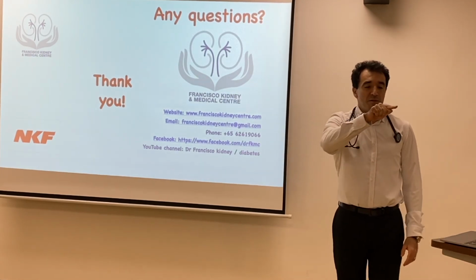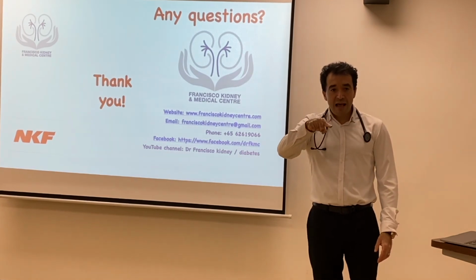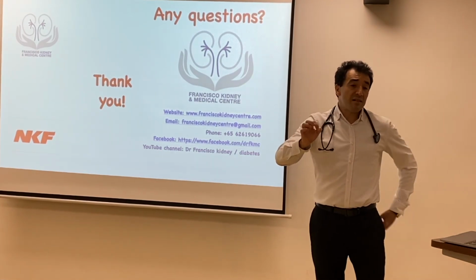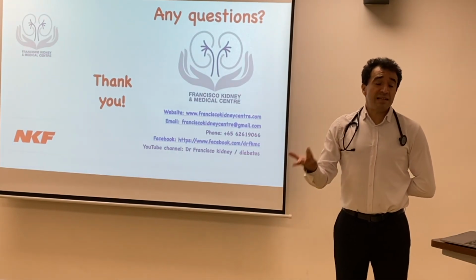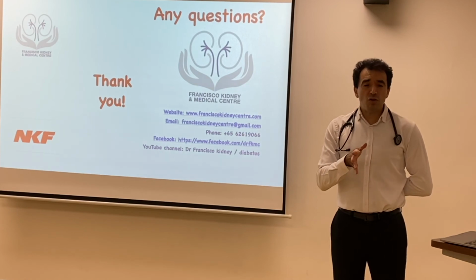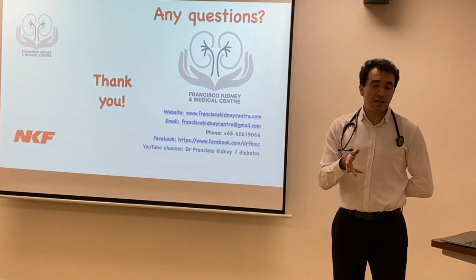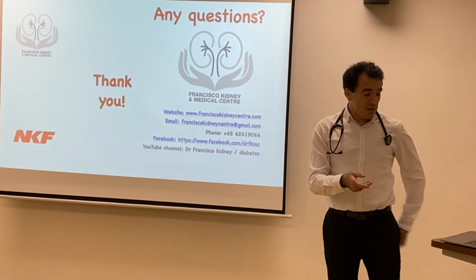A deflection could be there, but you don't see a proper P wave. So that's one of the characteristics of atrial fibrillation: there are no P waves, and it's irregular. Sometimes I know it's difficult. You are not sure if there are P waves or not, and this is more of experience. But by rights, you should not see them.